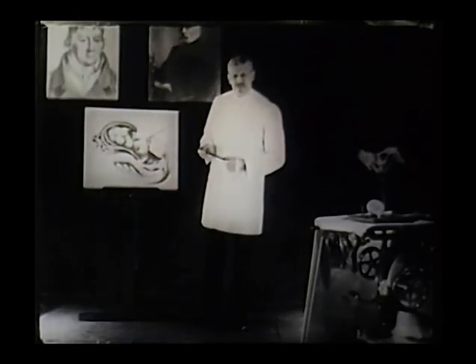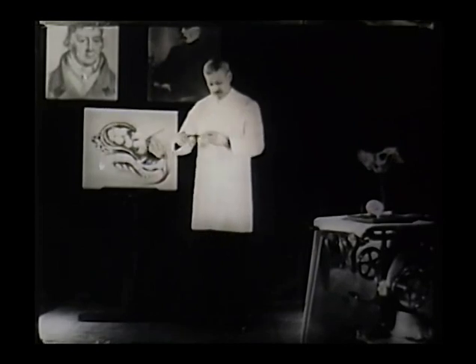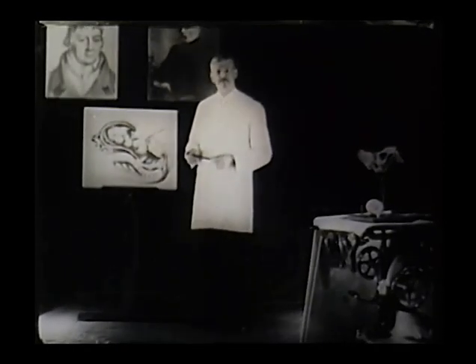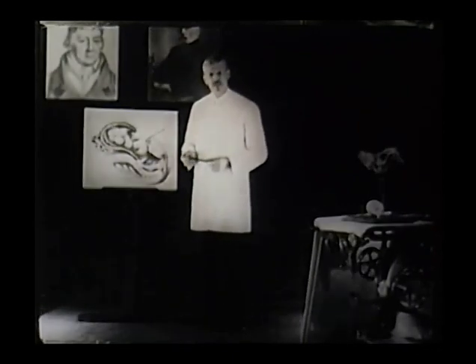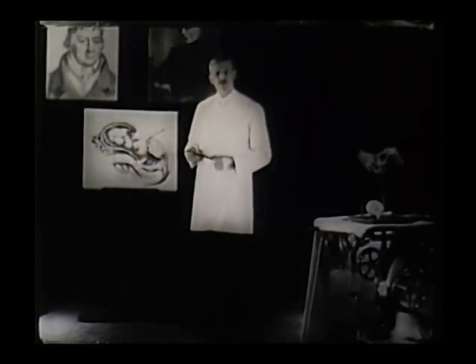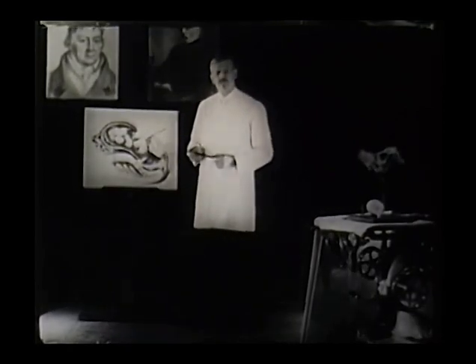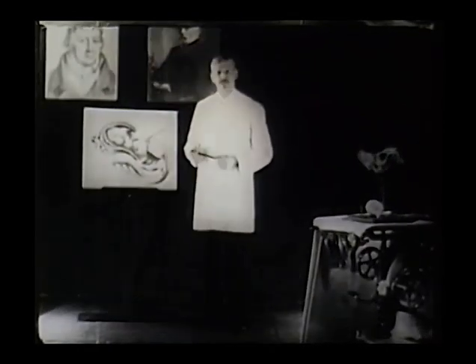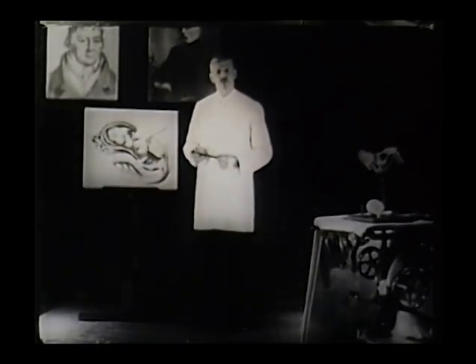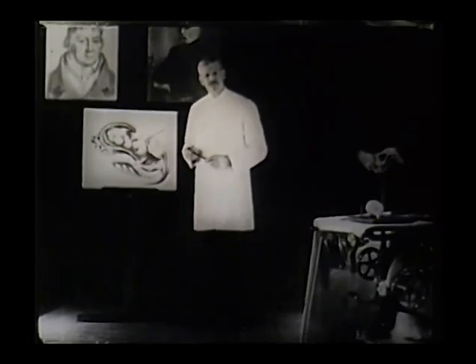The contraindications to the operation are very few. In a woman with a pendulous belly, it may be hard to get access to the lower part of the abdomen to make the incision. And if you are going to do a Porro, it is hardly worthwhile to do the low operation. But if at any time you have to do the old classic, make it as low in the uterus as possible so as to get as many of the advantages of the low operation as are to be had. Now a few words about the surgical anatomy.